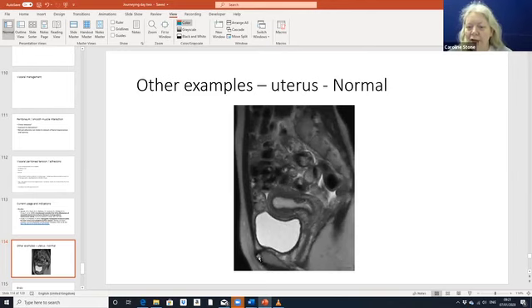This is the bladder, which is obviously quite enlarged at this moment, but that's because they filled it up, or they've made the person wait before urinating, so that the bladder stands proud to push the other organs or elevate them a bit for imaging purposes. We'll see that all of this is the intestinal mass, which is going to be having peristaltic activity all the time. And one of the things that it shows is that with that peristaltic activity, you can see that it would have a certain quality of feel.